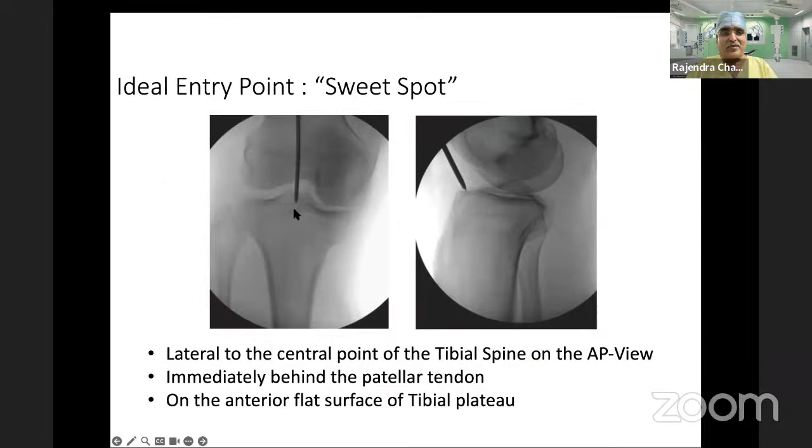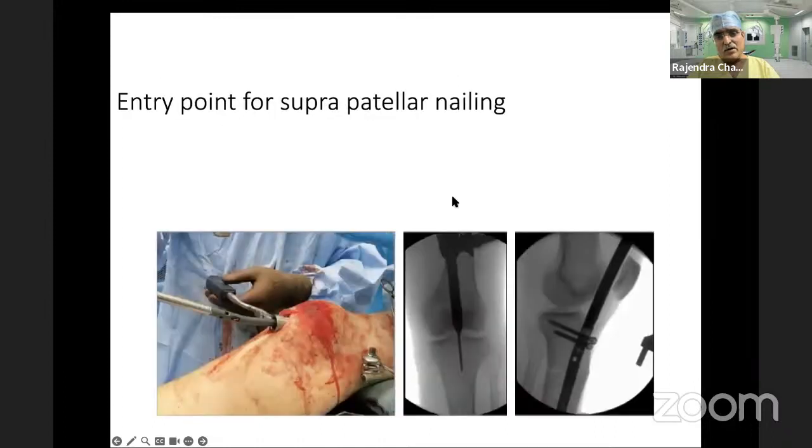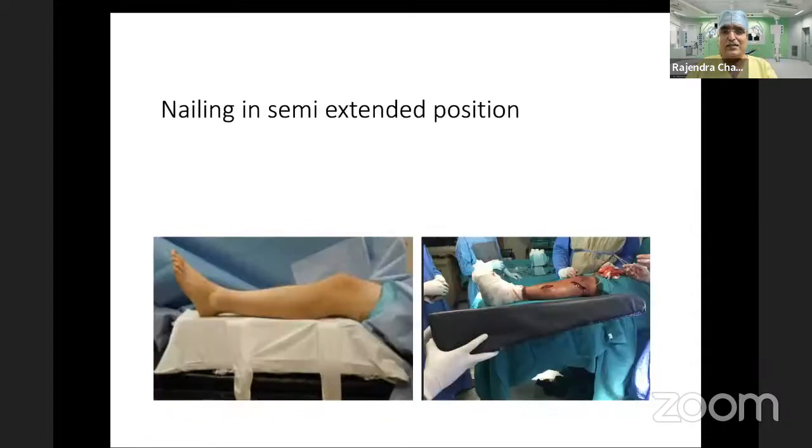So this is the way a poller screw is used, and of course a sweet spot, that is the high entry point. And I like to use a channel reaming here so that the reamer is not gradually translated anteriorly. That usually happened when I was not using channel reaming. The reamer, since it is flexible and making an anterior C, keeps on reaming the entry border. So if you use a channel reamer, that does not happen. So use a channel reamer, use nailing in extension.